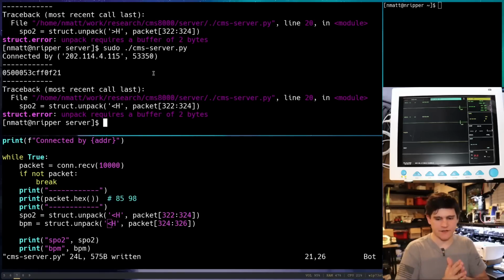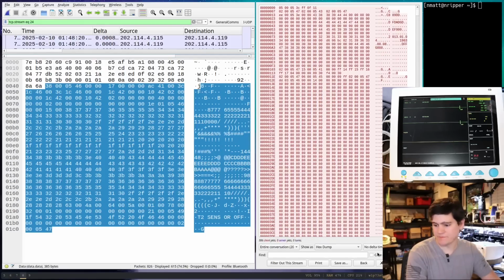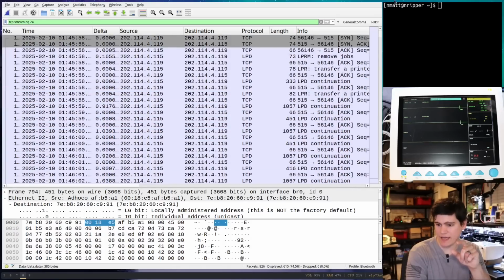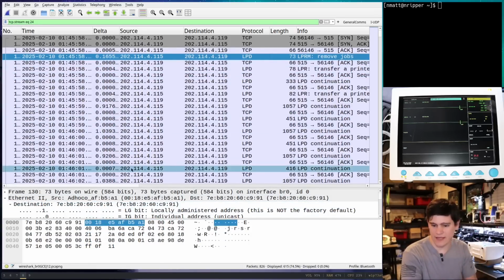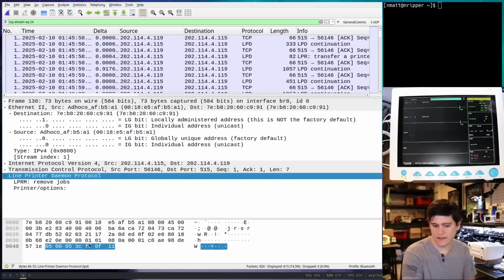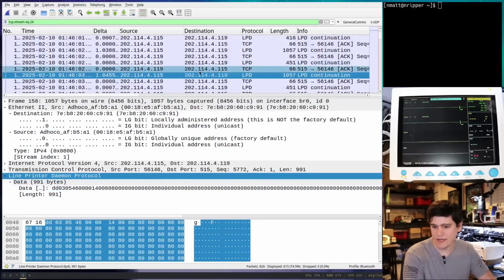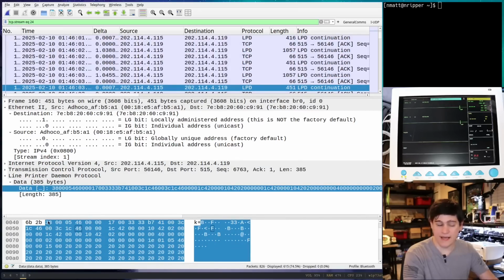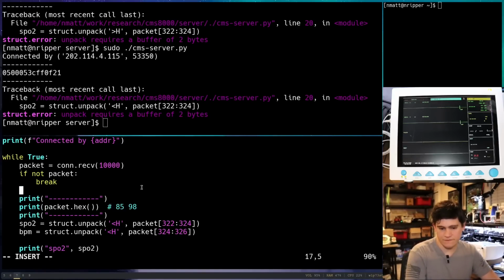Oh, that's right. I forgot a critical piece of code here. So right now, every packet, we're trying to parse every packet and find something at this really high offset. But we forgot that only the first time we get this packet right at the beginning that gives us all that patient data and stuff like that. And that is a lot smaller of a packet. You'll see here. Yeah, like this packet is only like what, 1, 2, 3, 4, 5, 6, 7 bytes, right? So we want to find one of these packets and see every one of them, like we were talking about right here. It has the first byte of 38. And so all we need to do is to put all this stuff in here.